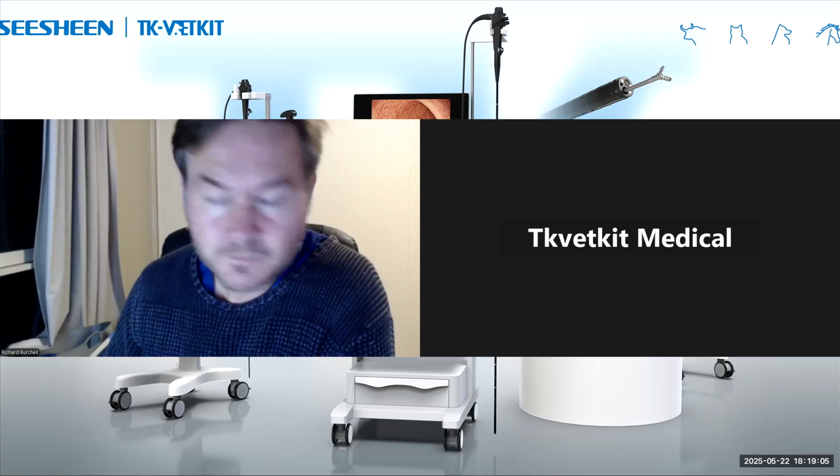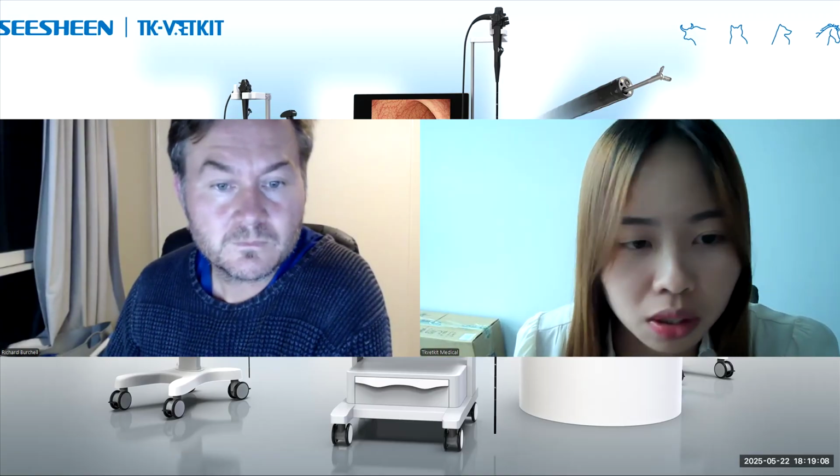Okay. Is it reliable if we use ETs with the bronchoscope?